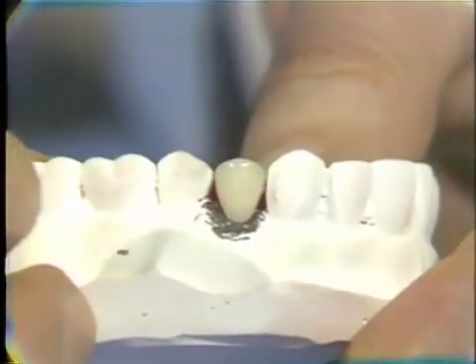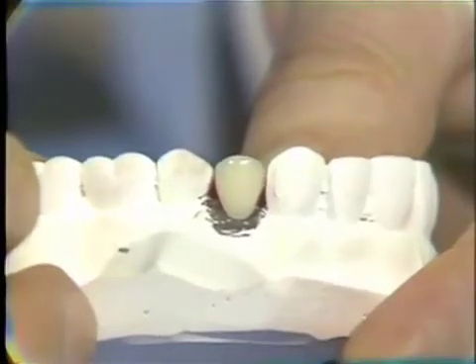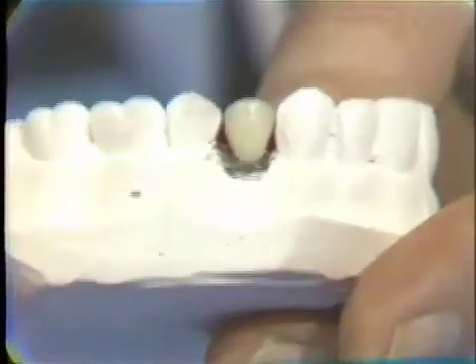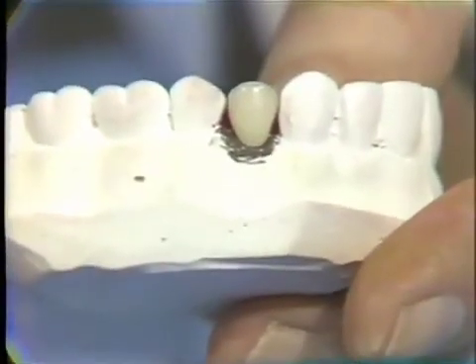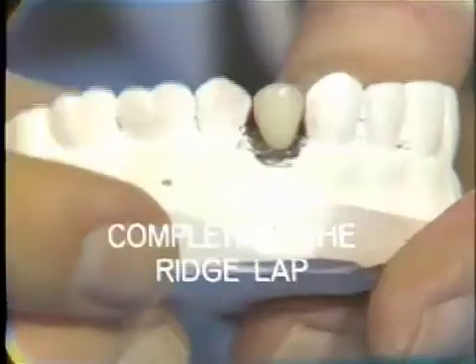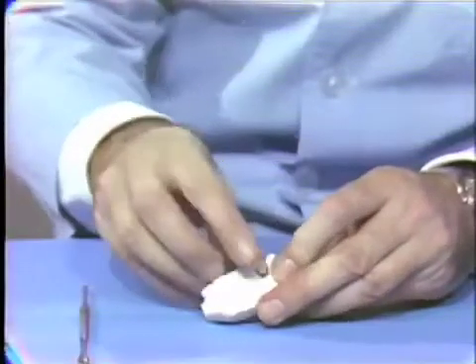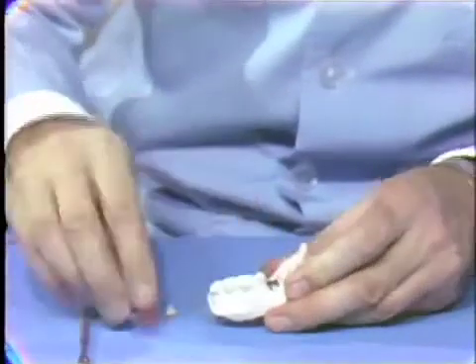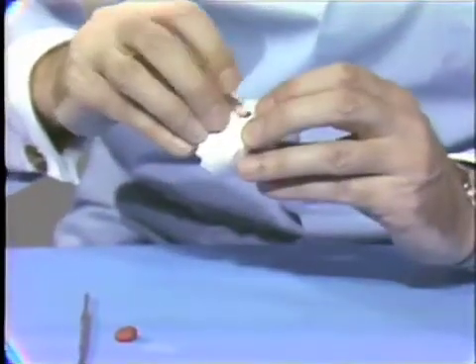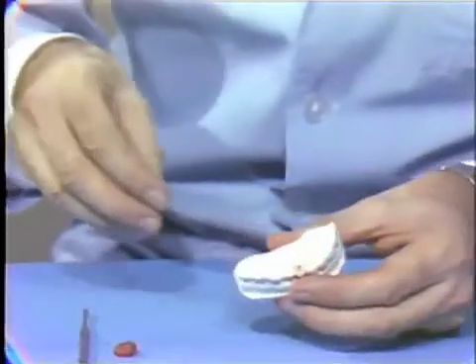And the next step that we've got to do is to finish off the ridge-lap relationship. We've developed the labial part of that, the part that goes against the mucosa. We haven't yet taken a look at the lingual surface to see whether we've got the desirable moving away of the porcelain in that area. So now we'll complete the ridge-lap relationship. This means taking away our wax on the lingual surface there, placing the pontic in position and taking a look at the lingual surface.